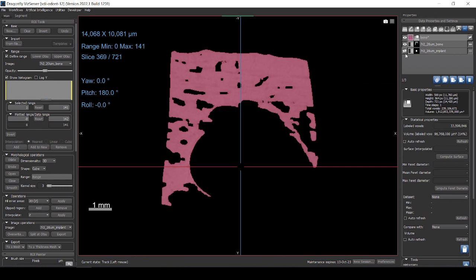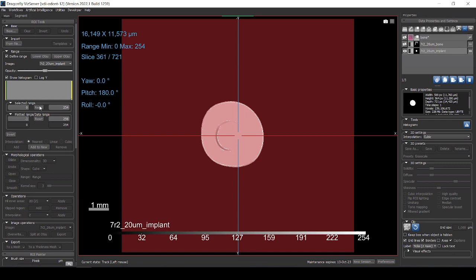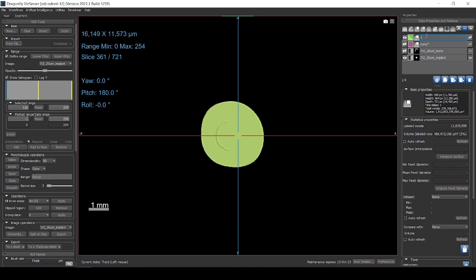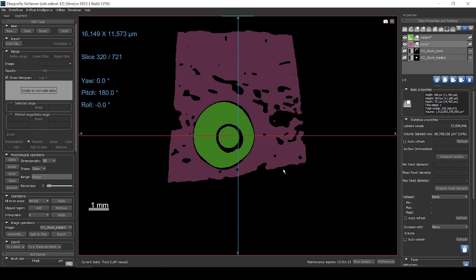I'm going to do the same now with the implant. So I have now two objects that are labeled differently. One is the bone and the other one is the implant. Now I can show both at the same time.